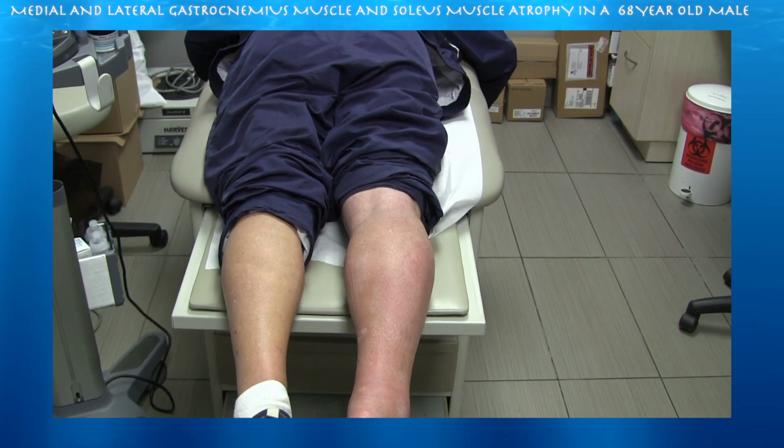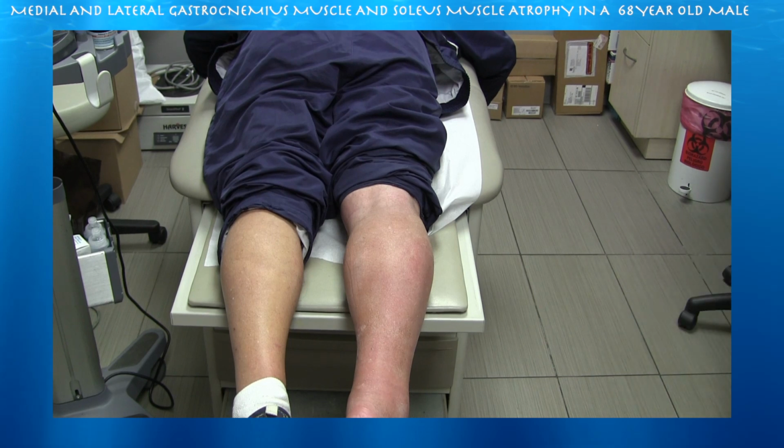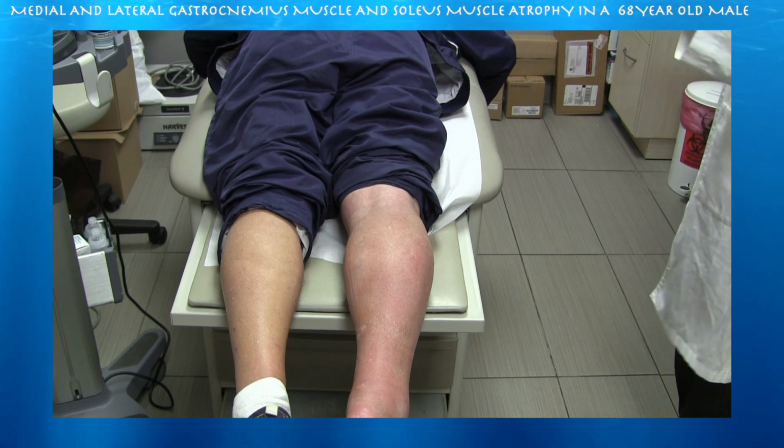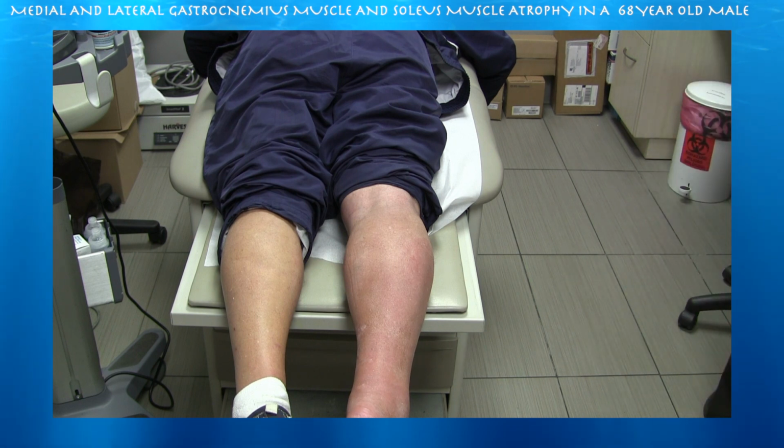Here's a patient, a 68-year-old male with swelling of the right calf going on for several months, like 4 months or so. More. 6 months. For 6 months, there was no injury. He did actually suffer a fracture in the right distal fibula about 6 weeks ago.